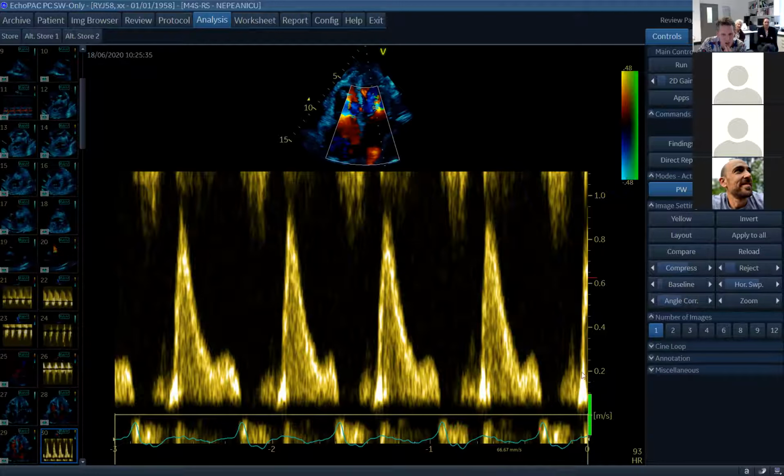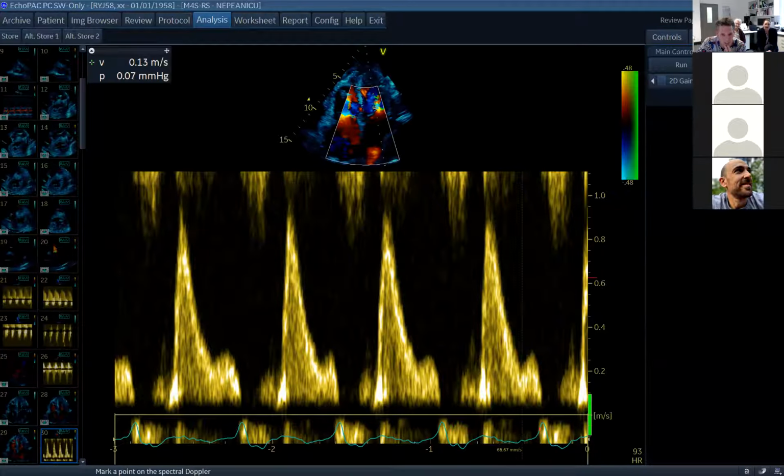I think if I was to turn that gain down, like down here, I think it's actually right down at that point there. If you can see my cursor, I think that's where the change is. I think all of this stuff is overgained. You see that's bright white in there? I think it's down there, which is less than 0.2.